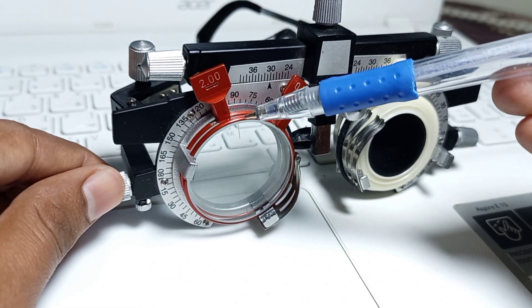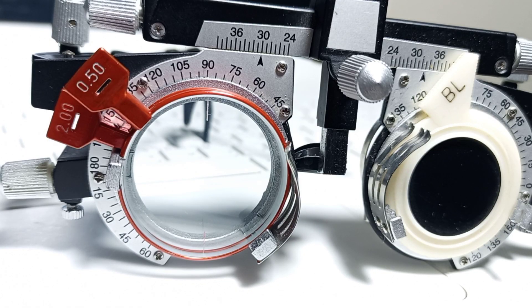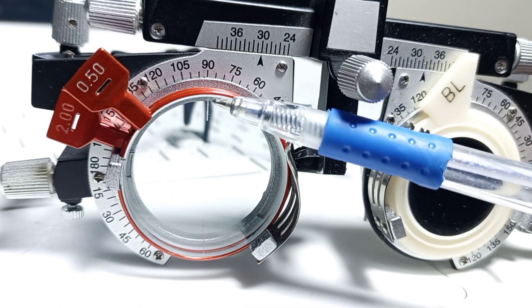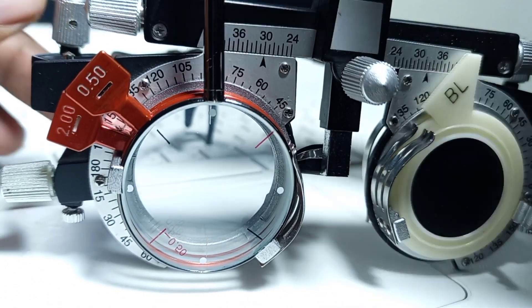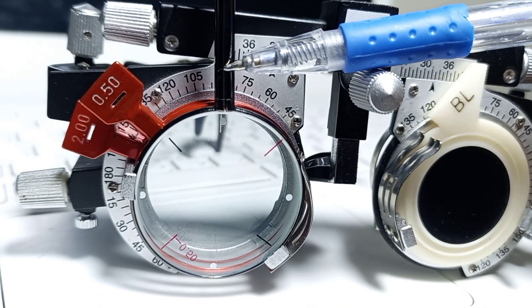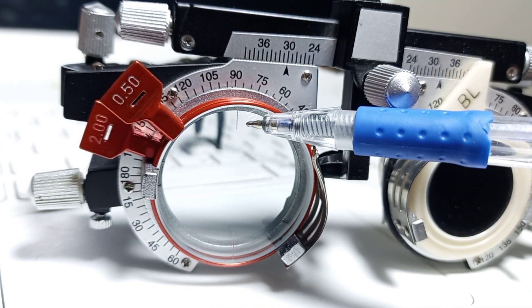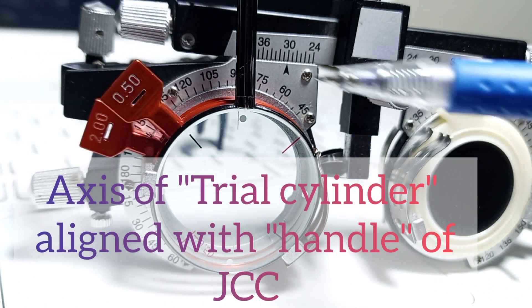As you can see, the axis of the trial cylinder is at 90 degrees. For axis refinement, you have to remember the key line: you have to align the axis of the trial cylinder with the handle of the Jackson Cross Cylinder. As you can see, this is the handle of the Jackson Cross Cylinder, aligned with the axis of the trial cylinder.